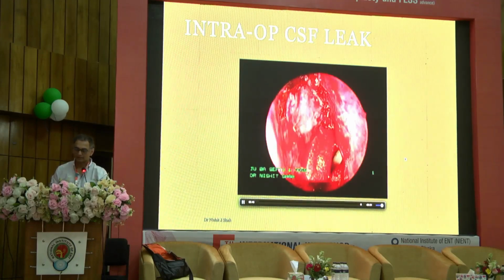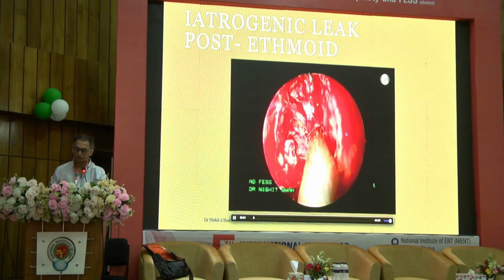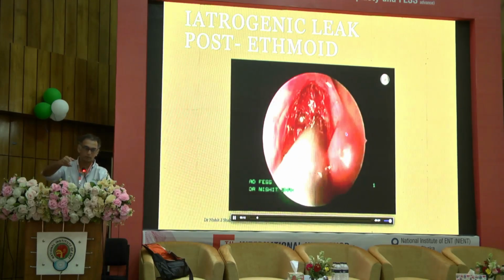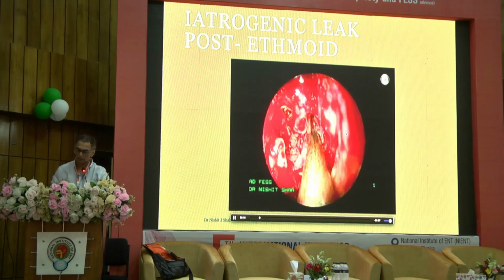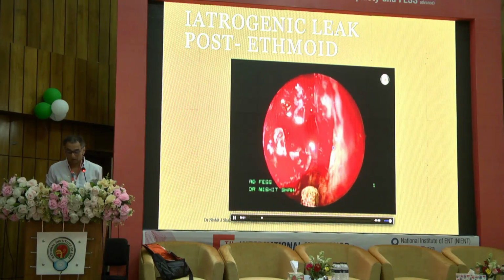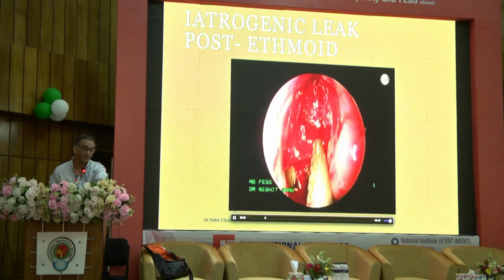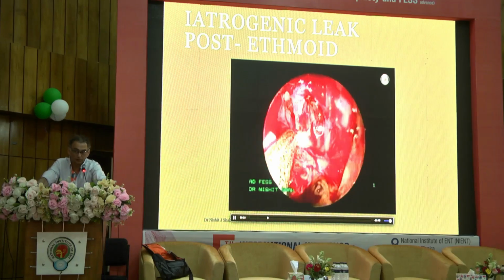Another patient, again we had finished all the surgery, polyposis. We were opening the posterior ethmoid. In those days, again 20 years ago, we were using a different technique of going into the ground lamella, putting a forceps in and then driving to try and open up the bone. And once that forceps came out, there was a gush of CSF. Unfortunately for me, this was a minister of the state. Fortunately for me, I had spent half an hour with him explaining all possible complications. His daughter was a doctor. I had spent half an hour with her individually explaining all possible complications.